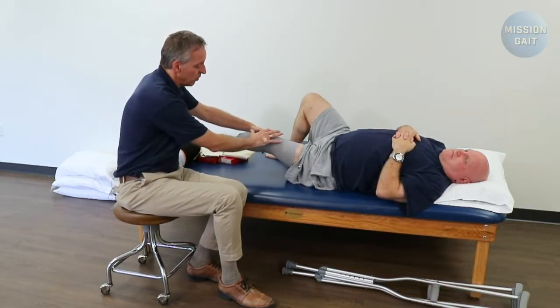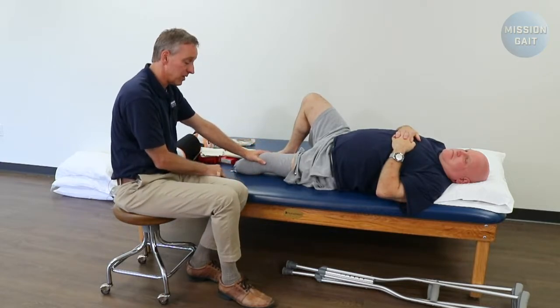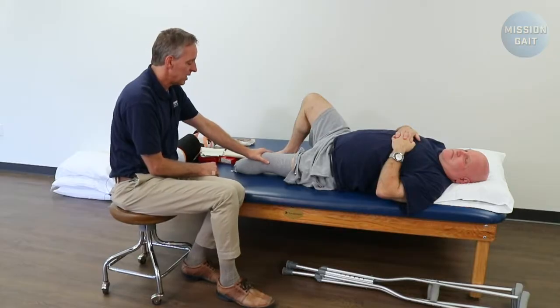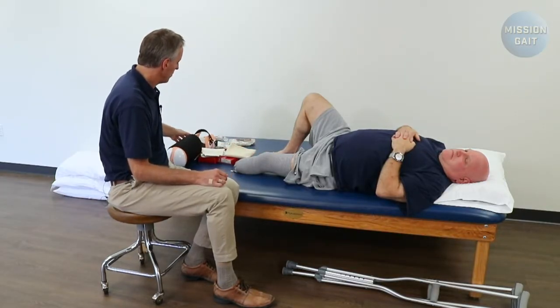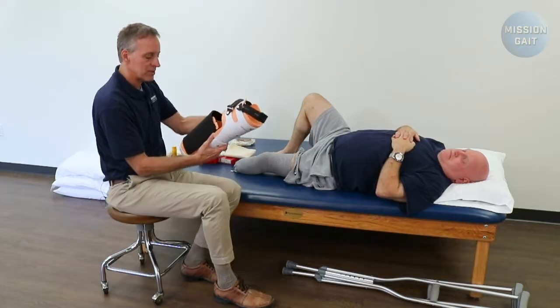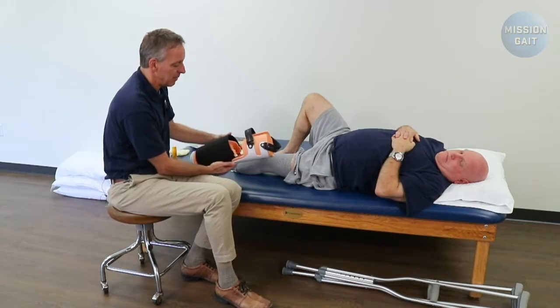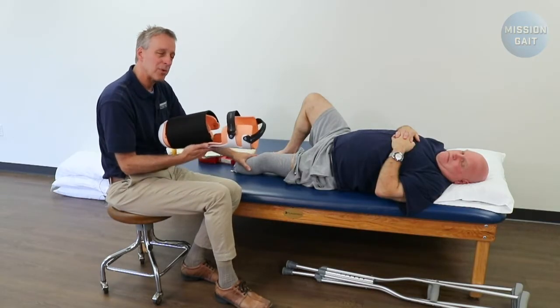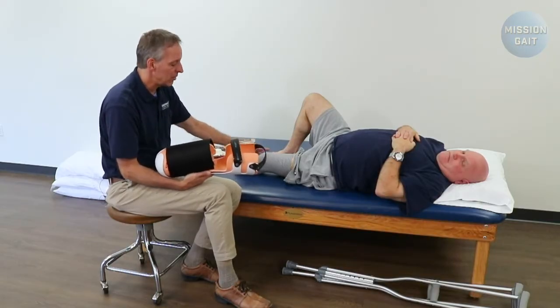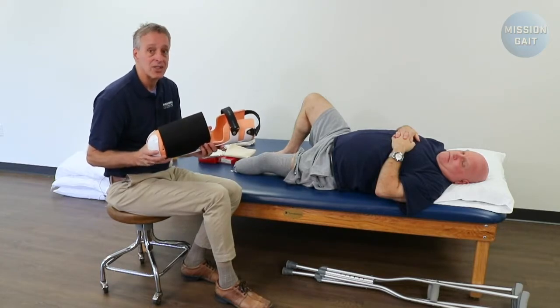Once the patient is stable in compression, the next concern is protection, because the most common reason patients go back into the hospital following amputation is falls and damage to the residual limb. There are a number of protection devices out there. Basically, it's a Velcro attachment — the patient slides right into it, pulls the Velcro over it, and it's a very simple fit. Some people think this is a shrinker — it's not. You have to have a separate compression device and then a separate protection device.